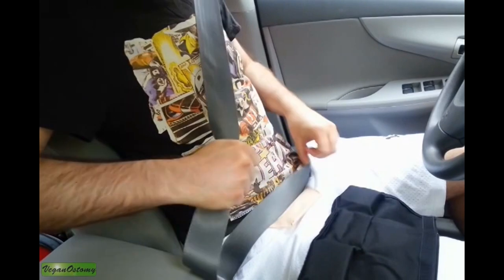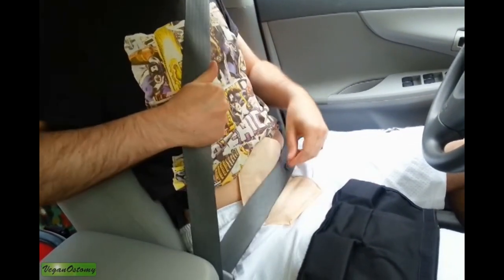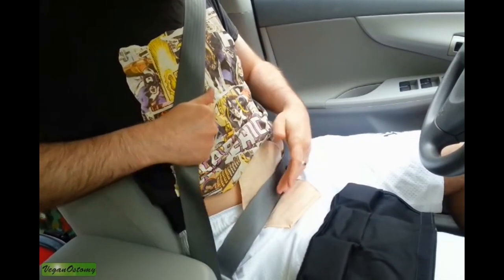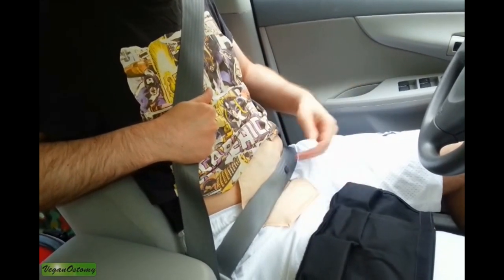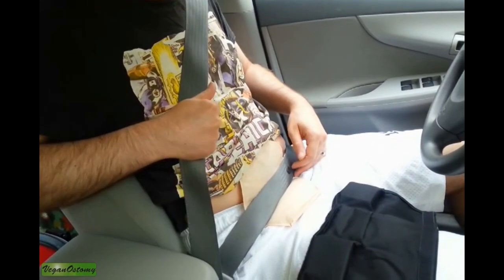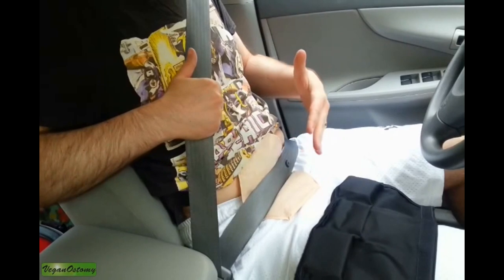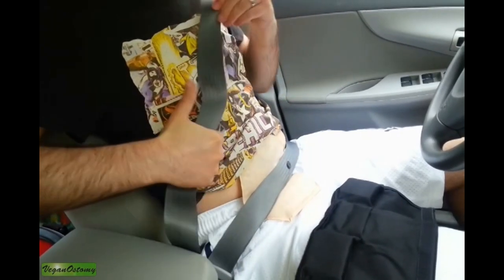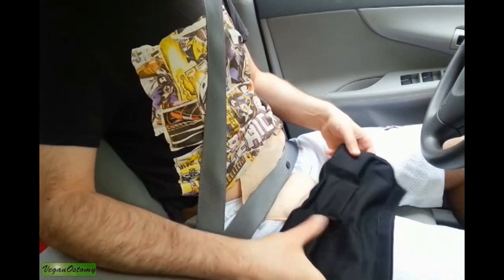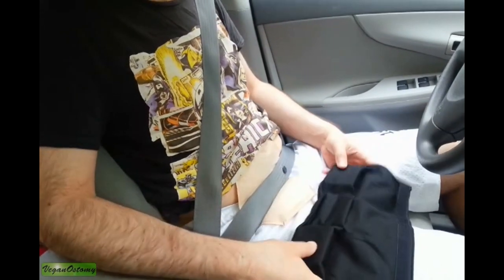I'm going to show you what my seat belt looks like over my ostomy pouch without the product. As you can see, it essentially goes right over my stoma, over the bag — it's really not comfortable, and I certainly don't want to be driving like that. Even if I have a minor accident, that probably wouldn't feel very good on my stoma.